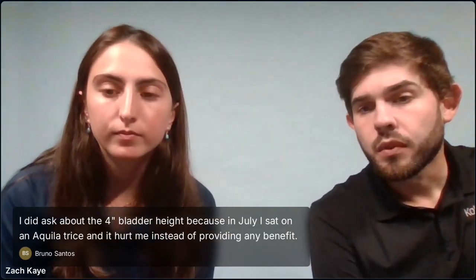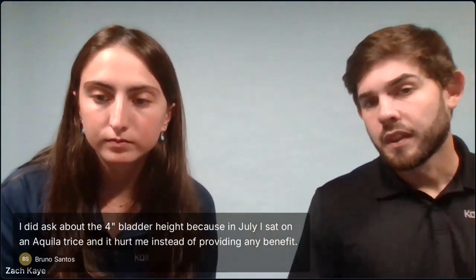Yeah, Bruno. For that company in specific, I'm not sure how high their different air bladders are, but you're able to adjust the height of our air bladder. So if you had too much pressure, let's say under your thighs, and you needed to lower that, you could go into the phone app like Penelope just had up, click on the thigh bladders, lower that down to where you felt had a little bit less pressure, and then you could save those settings and be good to go.